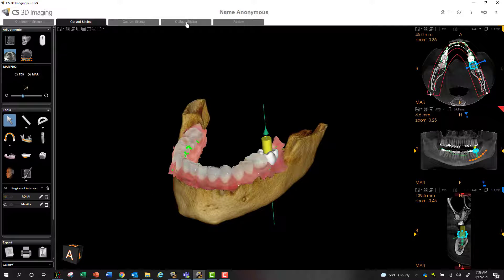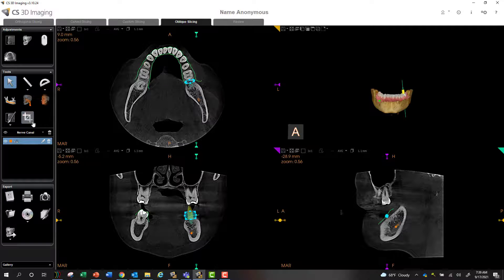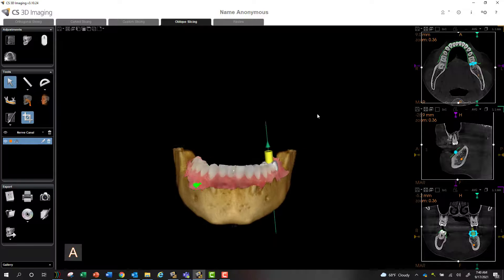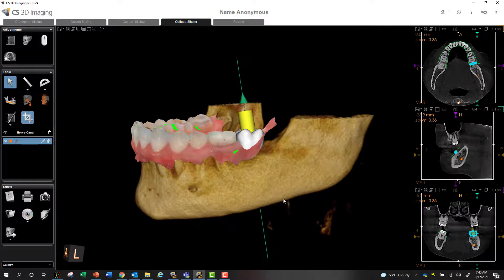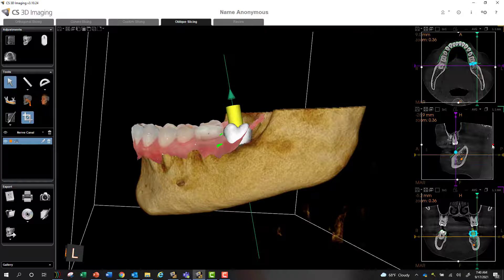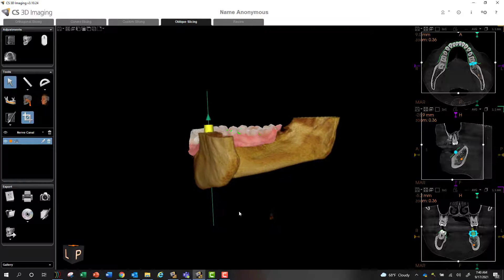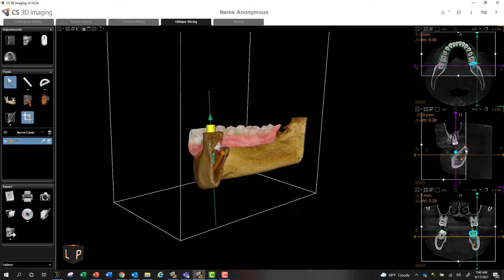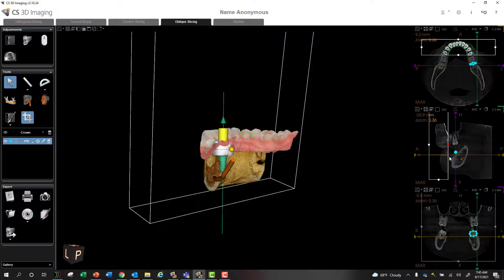But beyond that, we can go to our oblique slicing tab, and this can do a variety of different things. We can actually see this little cropping tool. When we select this, we can see it adds these little nodes, and we can enlarge our 3D rendering. On the right-hand side, we still have our orientation views. You can grab these little nodes to slice through the scan. Position your 3D rendering like so, grab your little node, and now you're just slicing through the bone. Just a really nice wow factor to bring a little extra to your case presentations.